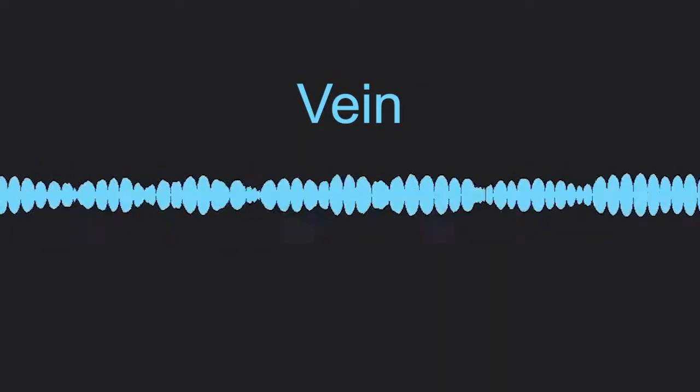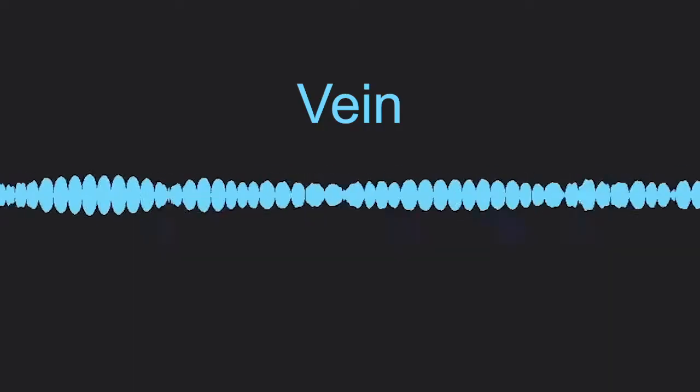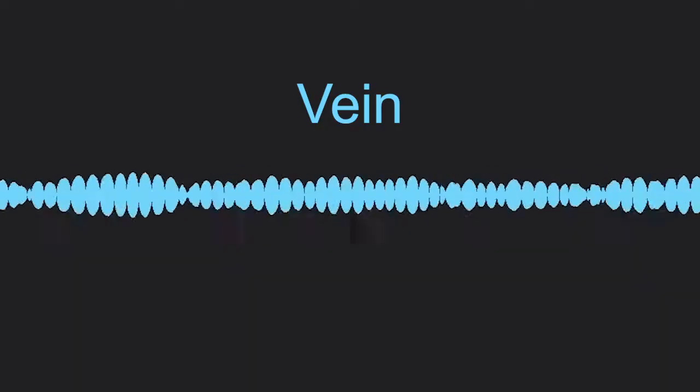If you find this sound, it is likely you are listening to a vein rather than an artery. Relocate the Doppler and look for a pulse.